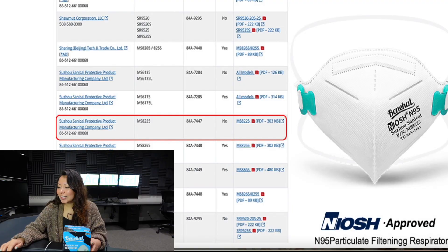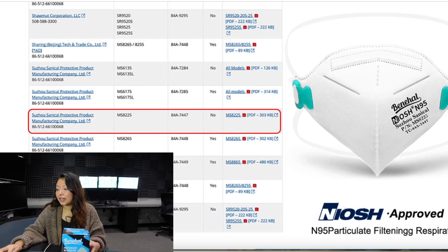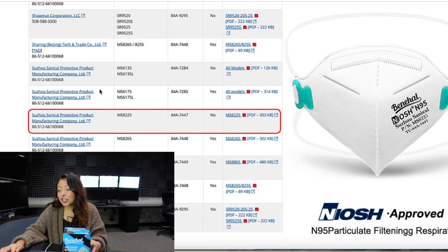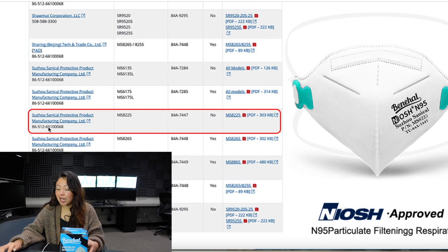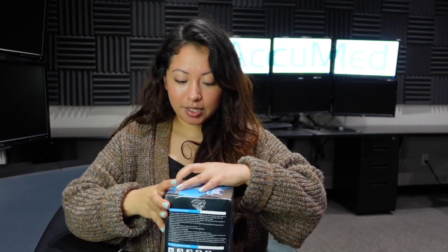It says overall results that it passed. We're going to see if this mask passes our TSI machine test. Scrolling down, we also have the NIOSH approval. This is a website that provides you with all the approved NIOSH N95 respirators, which I will be linking down below if you want to do your research. It provides you with the manufacturer's name along with the model and the approval number.